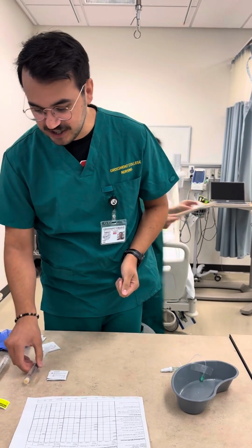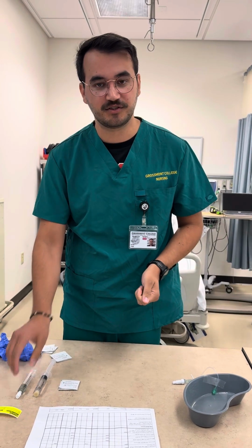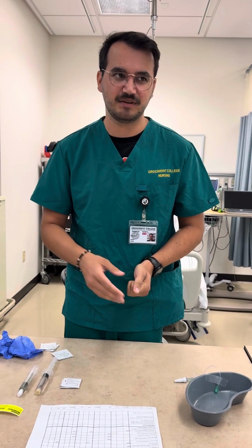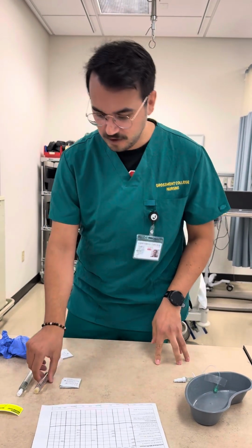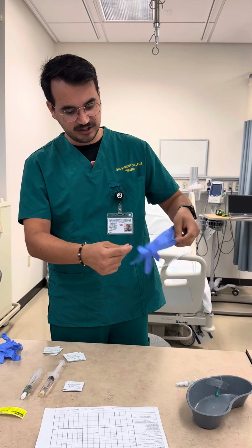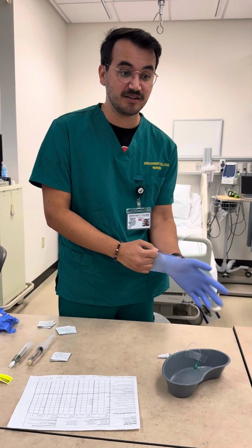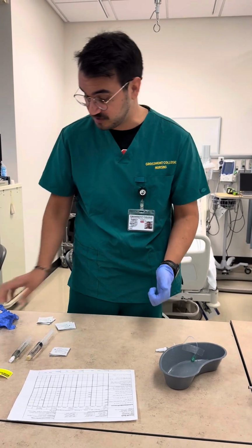All right, this medication can be given every 8 hours as needed for that nausea. Sorry, every 6 to 8 hours, but I think it's written every 6. So I'm going to don gloves, after I've performed hand hygiene and instructed the patient what I'm going to be doing, and letting them know any particular side effects that they may experience as well.